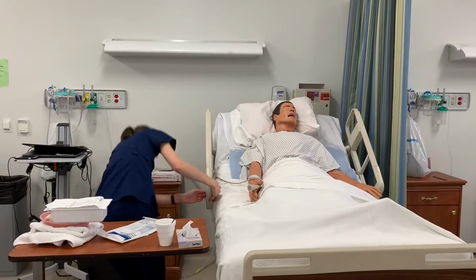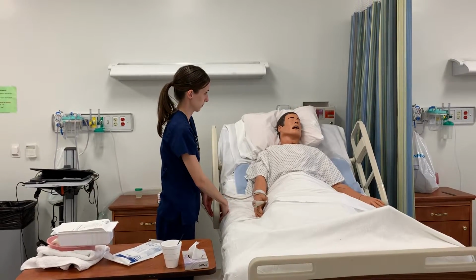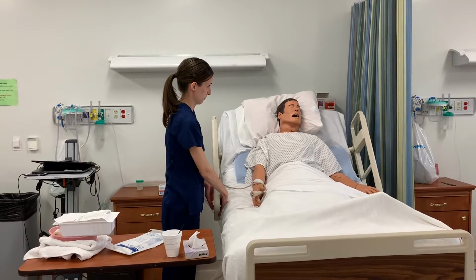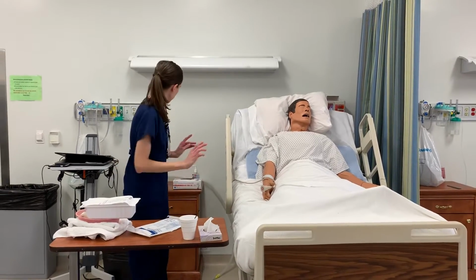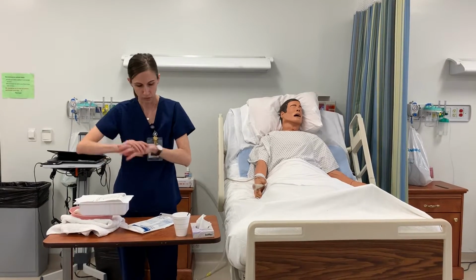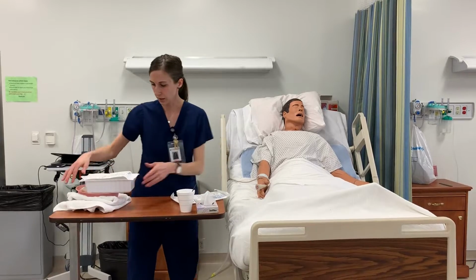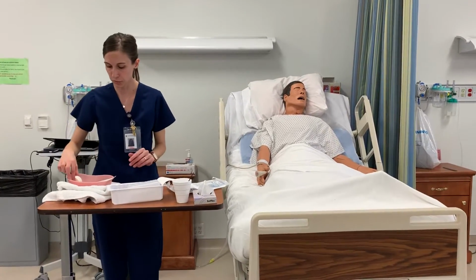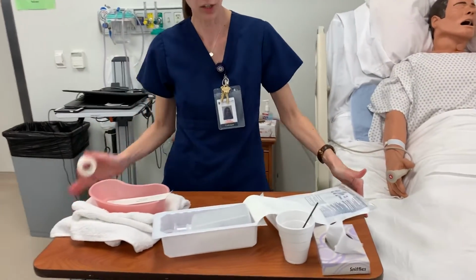Verify. Alright. So I'm going to be setting up my table over here. I'm just going to do some hand hygiene one more time. I'm going to move this to the side and open this so that way I can just use this surface to put my tape.